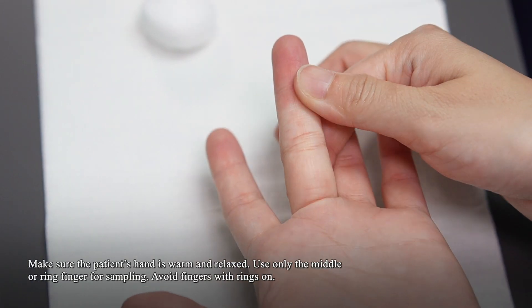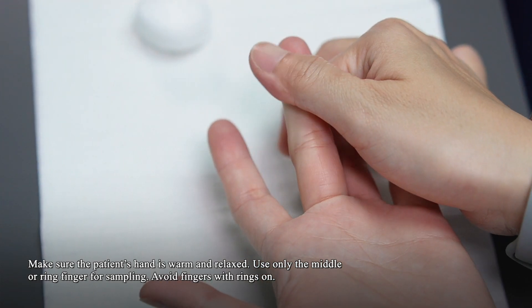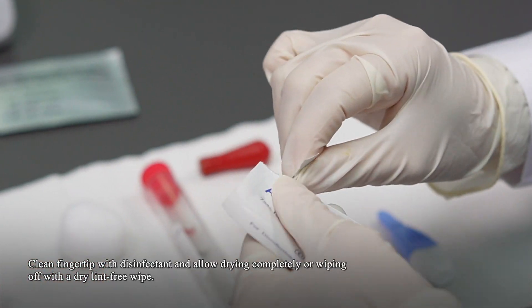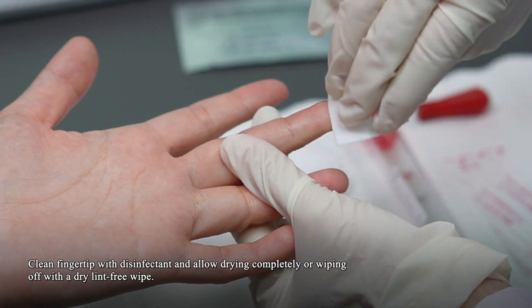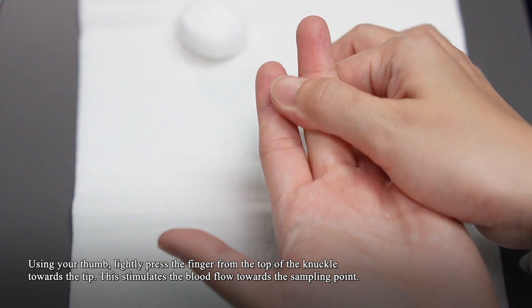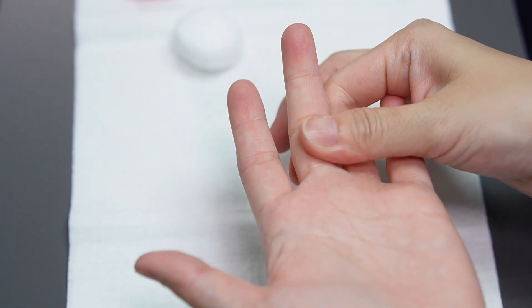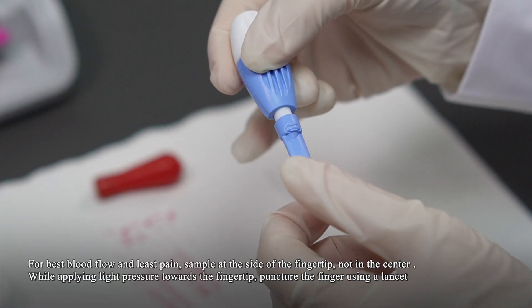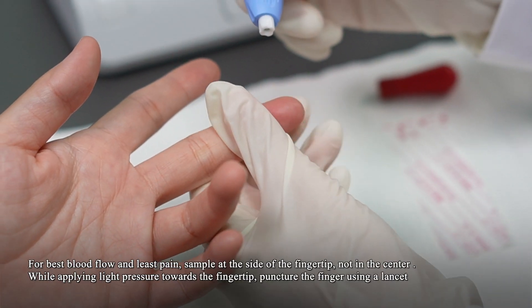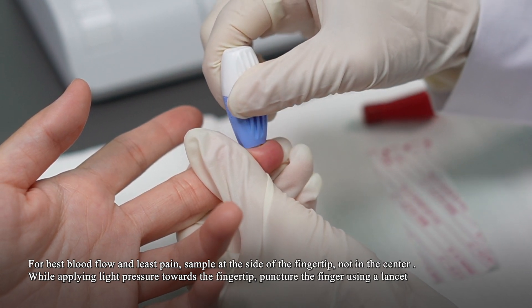Make sure the patient's hand is warm and relaxed. Use only the middle or ring finger for sampling. Clean the fingertip with disinfectant and allow it to dry completely, or wipe off with a dry lint-free wipe. Using your thumb, lightly press the finger from the top of the knuckle towards the tip to stimulate blood flow towards the sampling point. For best blood flow and less pain, sample at the side of the fingertip, not in the center. While applying light pressure towards the fingertip, puncture the finger using a lancet.